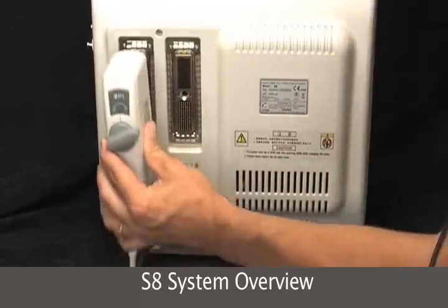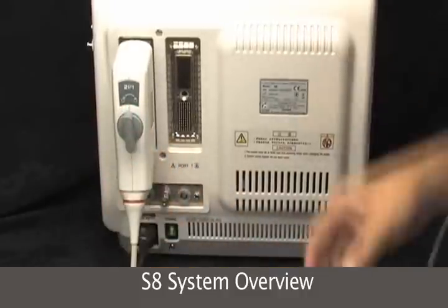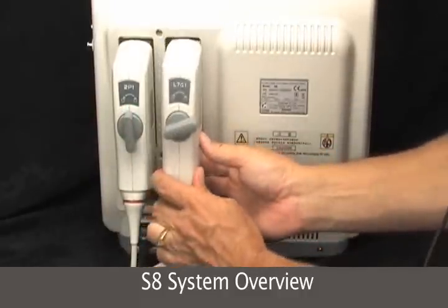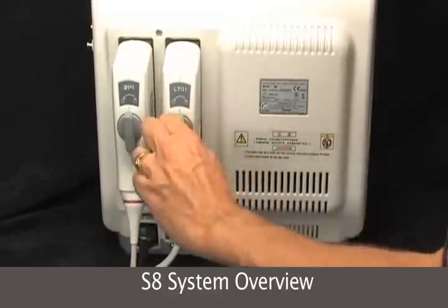So inserting the transducers — you hold it by the switch, push and twist. Set it in, hold it by the switch, push and twist — very simply.